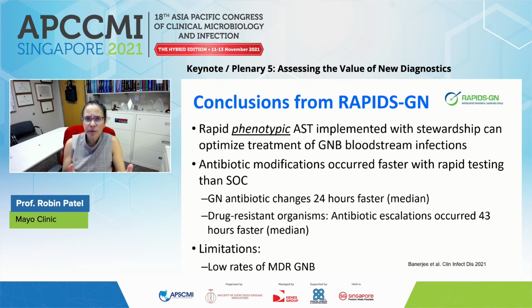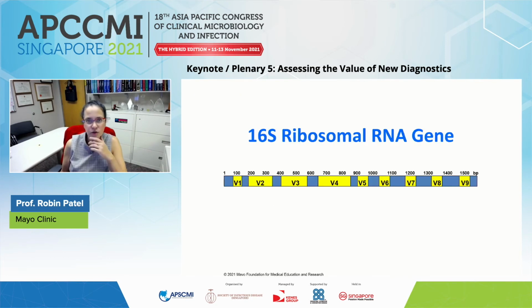Hsien, we implemented both of these technologies in our laboratory, but in certain patient populations. So the BCID we use for gram-positive and we use for yeast. The Accelerate Pheno that does this rapid phenotypic susceptibility, we do for gram-negatives, and we always apply these rapid diagnostics with stewardship.